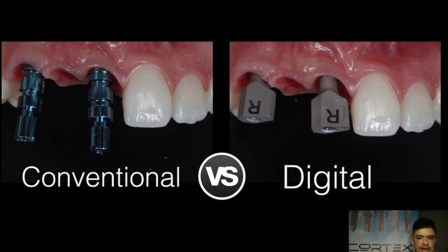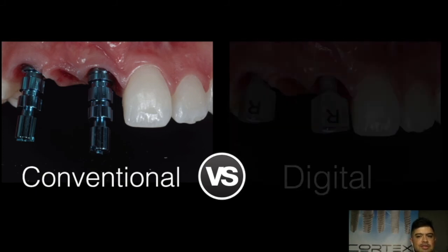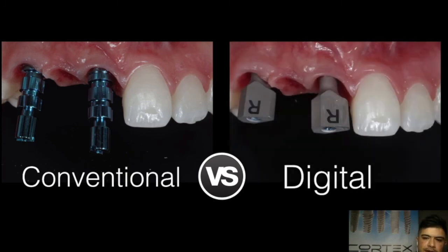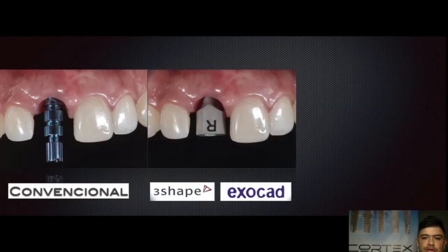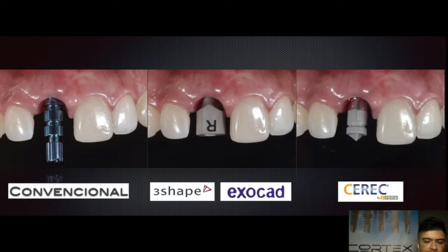Actually, in some cases, you can also use the digital protocols for impression and to do the final restoration. When you use digital protocol in this type of implant, you have available the more famous protocols like the 3Shape one, the Exocad, and also the CEREC from Sirona protocol.